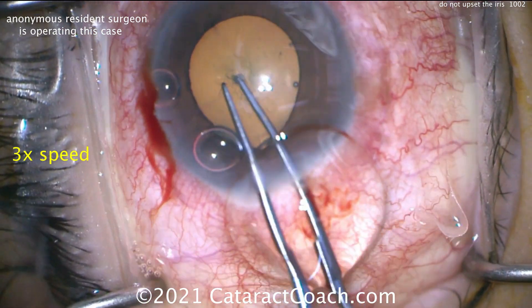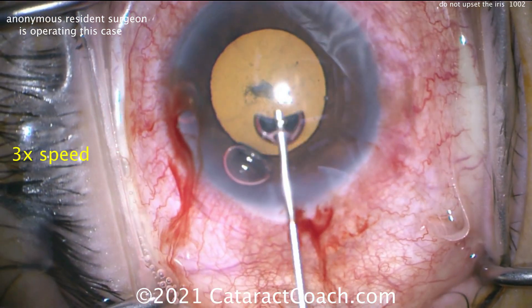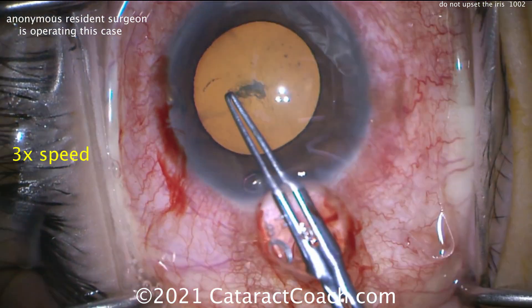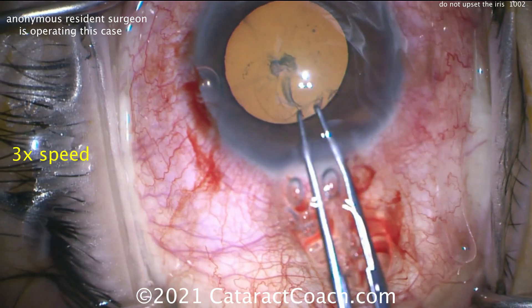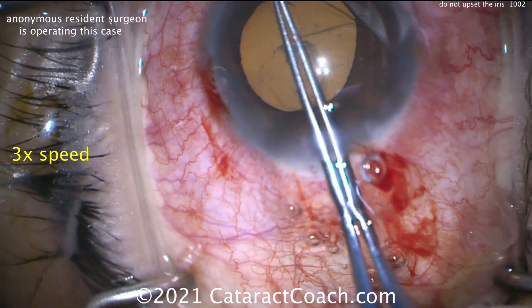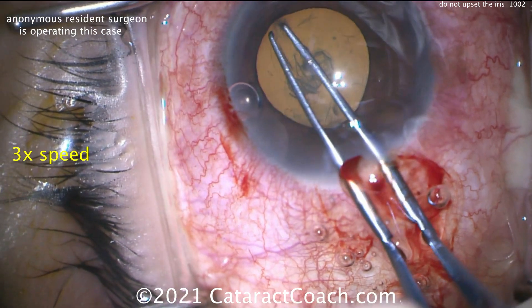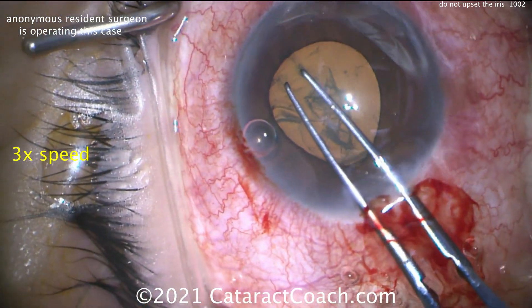All right, time for the rhexis. Small eye, hyperopic. The speculum is cranked. There's the viscoelastic loss, and look at that — peak pupil. Here comes the iris, it's going to pop out of the eye. Trying more viscoelastic, going with the forceps, trying to start a rhexis. There's the beginning of the rhexis. So far so good, but losing a lot of viscoelastic, still with a reasonable pupil size, so continue.